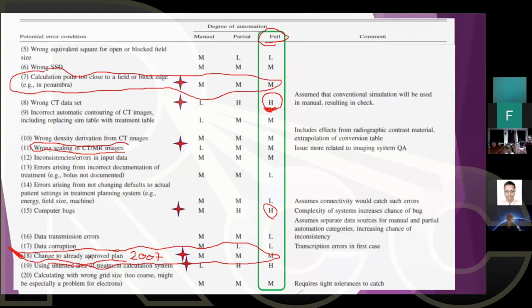They already had a note that this patient was on hold because of plan revision. So in this case, the therapists were better than the planners and us physicists. It really takes the entire team to second check each other. They were able to realize that they had 2 approved plans.